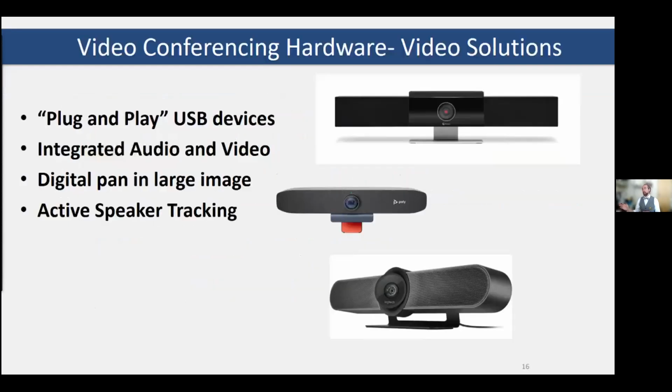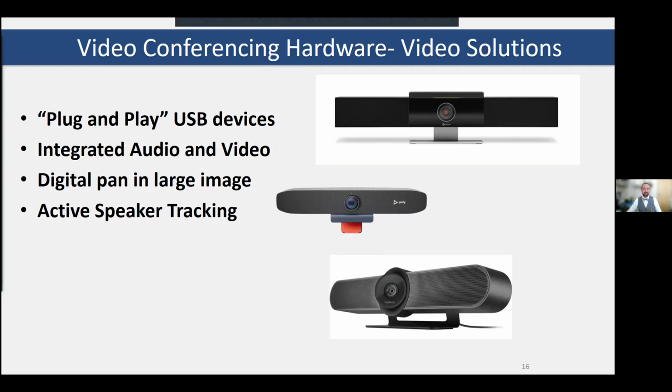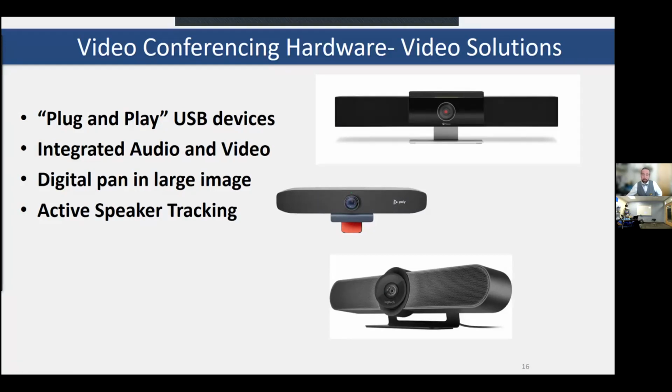So switching back into the more demonstration-focused portion of this, we want to talk about some of the video conferencing solutions, or the hardware peripherals, as a part of the showcase here. Video conferencing still is generally the most common telemedicine delivery method, whether it's directly to the patient's home or in a local setting, like live video, like what we're talking in now.